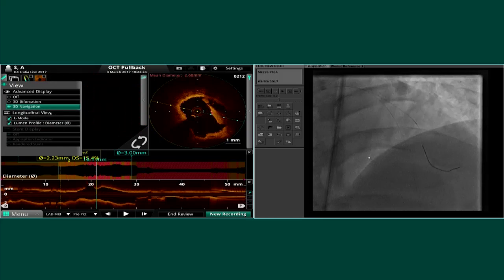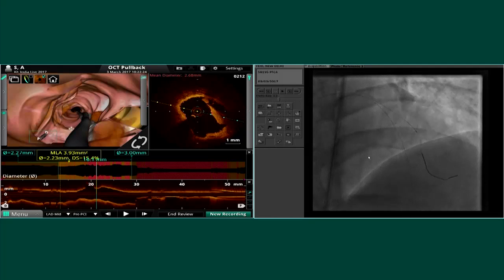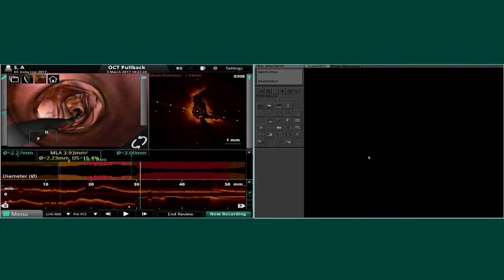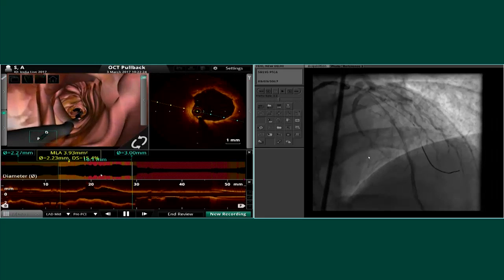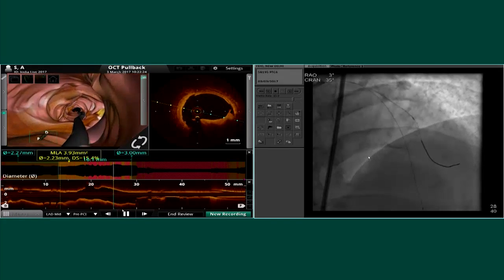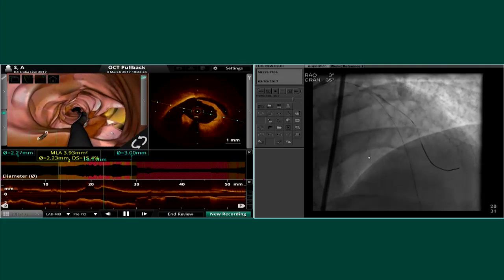Be careful using automatic bifurcation detection because here the software is trying to detect the bifurcation. And you know, if you have a dissection flap, it might detect a bifurcation by its detection technologies. I'm not sure if you have to believe in that one.